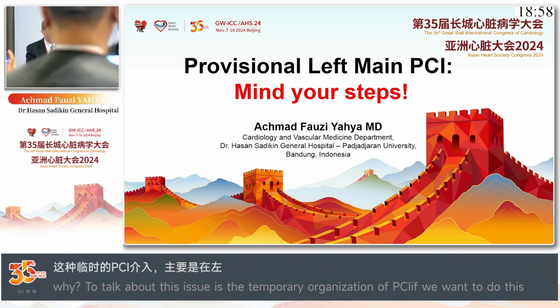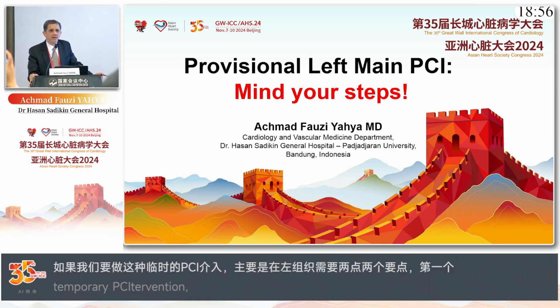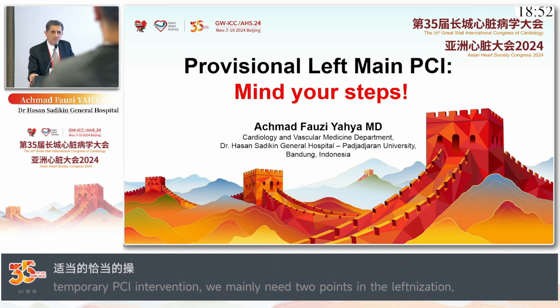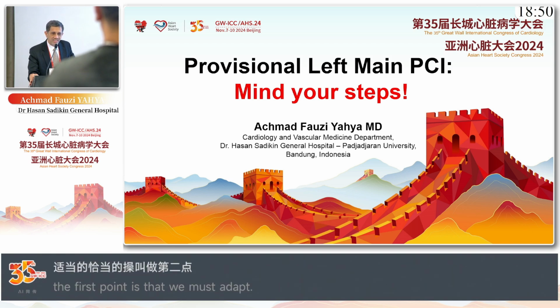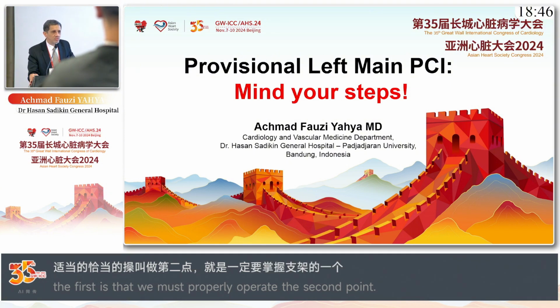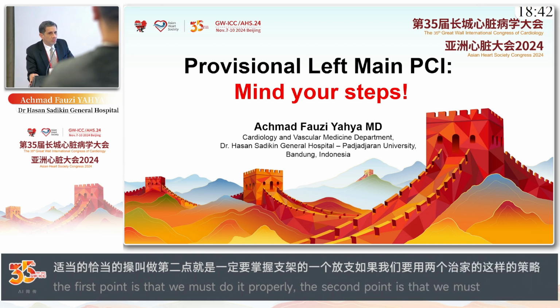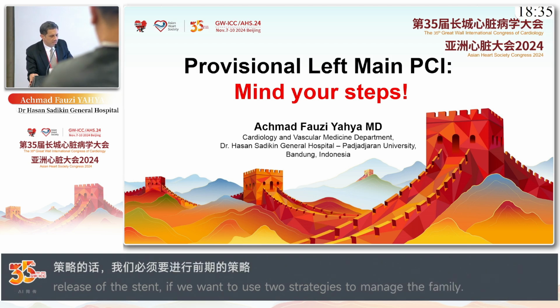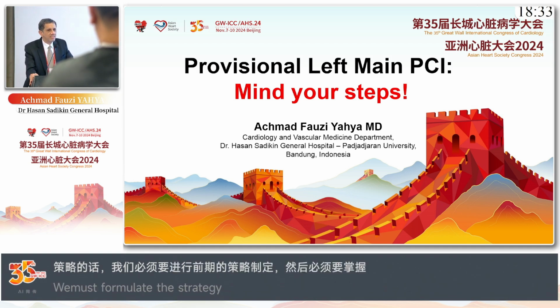First, we have to do it appropriately, and the second one, we have to master the two-stent technique. On the other hand, if you are going to perform an upfront two-stent strategy, we have to do the upfront strategy appropriately and have to master provisional PCI.